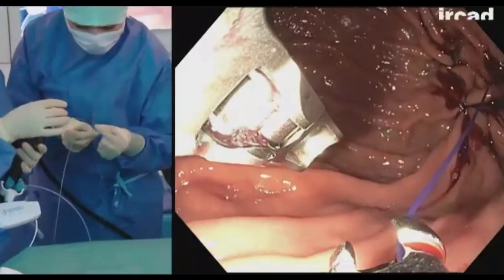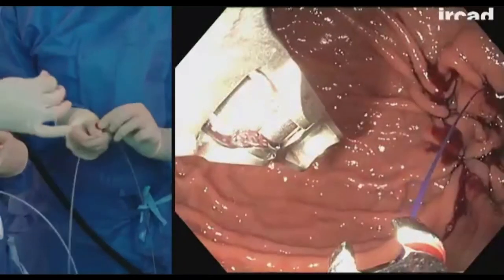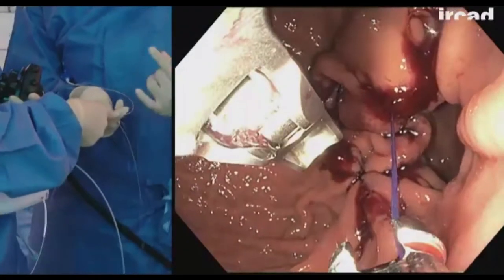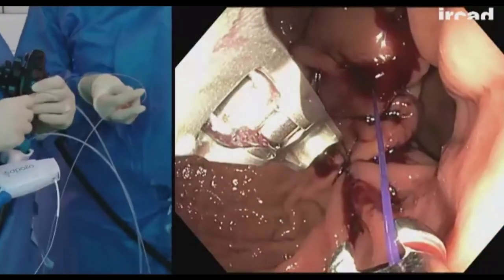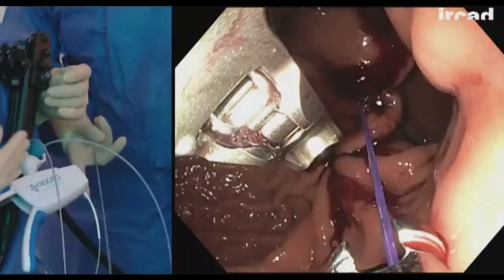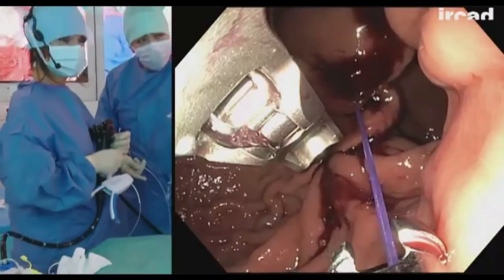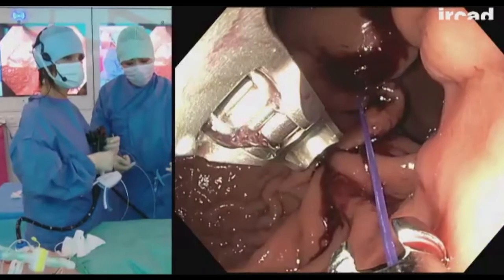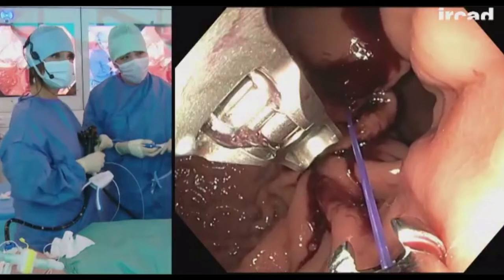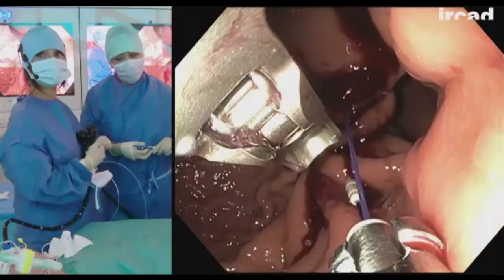In order to cinch, we're gonna use a cinching device that is gonna trap the suture into position. It's just a plastic cylinder. Just gently, gently, okay. That I'm gonna slide and use to secure the suture. Very important, very little moving, and always push your cinch parallel to the suture, not perpendicular, because otherwise your suture is gonna go. I like to hold the suture myself at the beginning. When you're learning, you can have your assistant hold the suture.